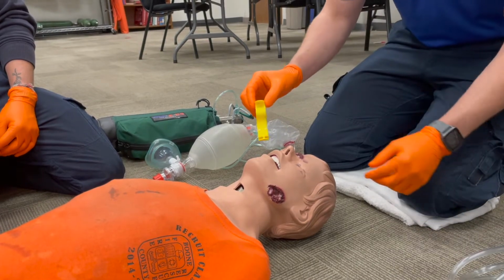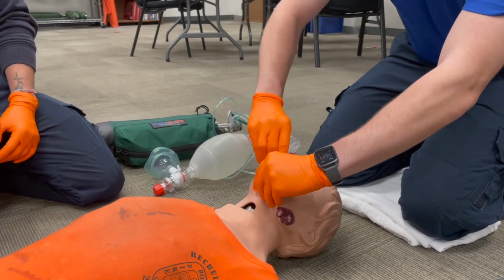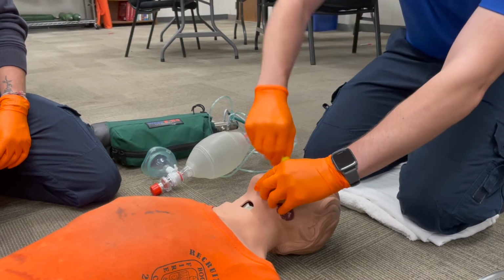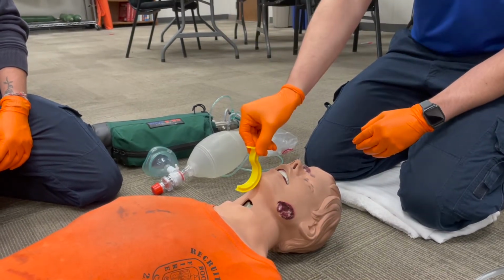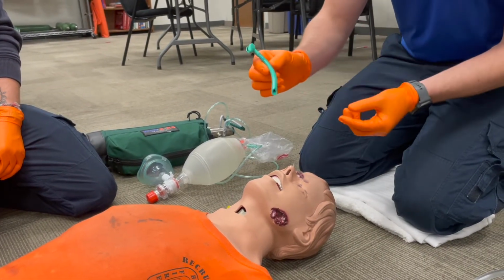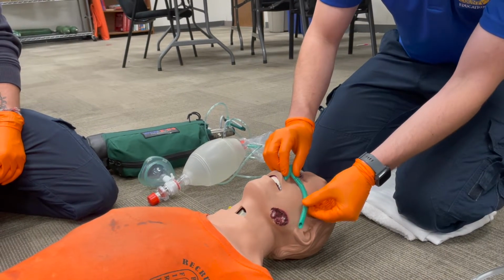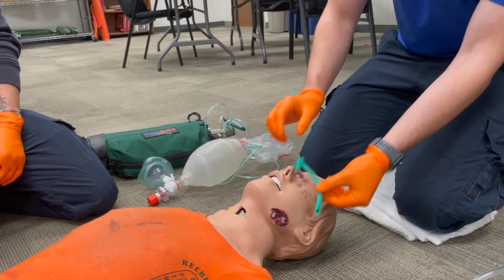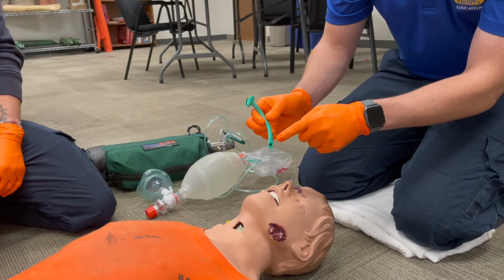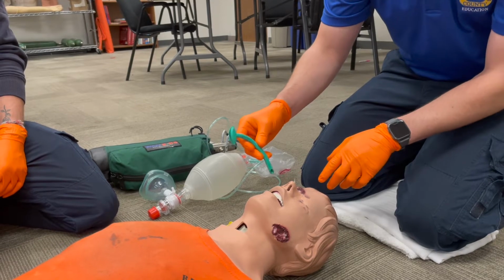And then to insert this, again, you can turn it sideways and place it in the patient's mouth and then turn it like so. So you're basically doing an in and then a turning motion like that. With the NPA, you're going to size that from the nose to the tip of the earlobe, right about the same area as you would with the OPA. If you're just using one NPA, it's good to have the bevel edge face towards the patient's nasal septum, so the middle of their nose.